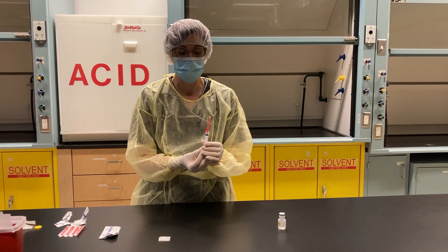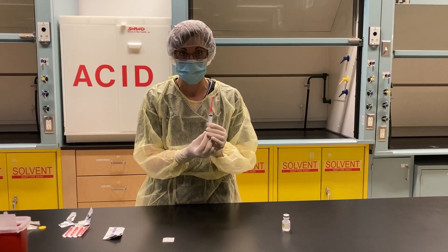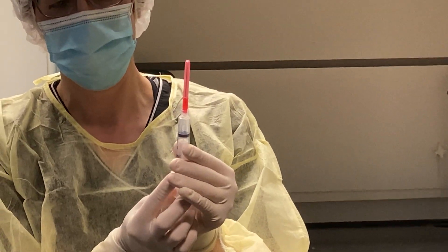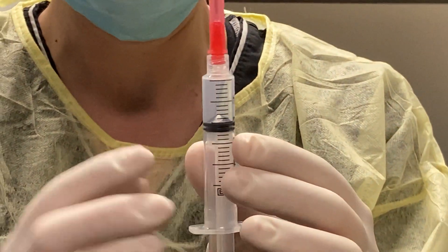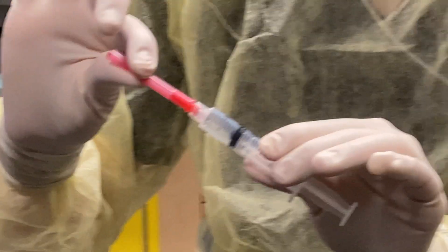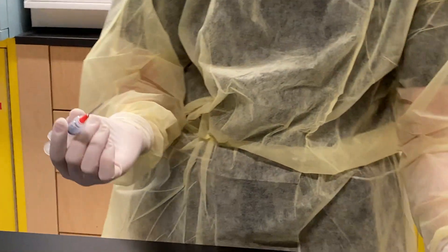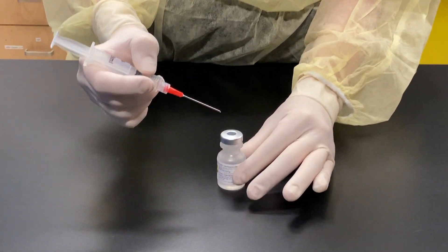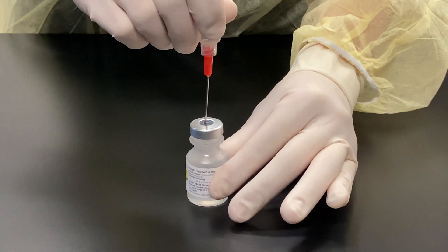We're going to use the milking technique. In this case I'm going to draw up two mils of sodium chloride 0.9%, so I have to draw in air up to the amount of volume that I will be removing from the vial — in this case it's two mils. I'm going to remove my needle cap. Grabbing my vial and going in at a 45 degree angle and then moving to a 90.